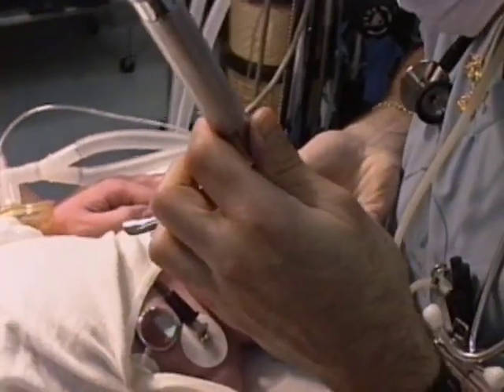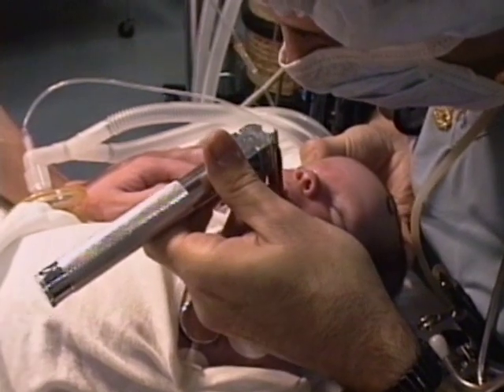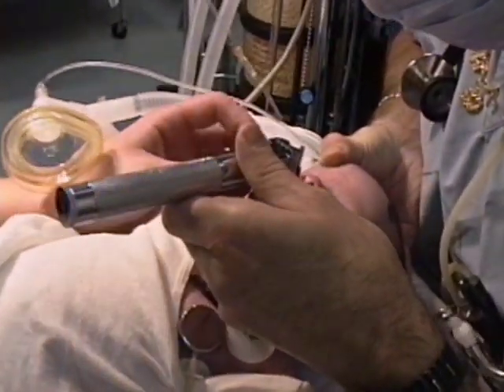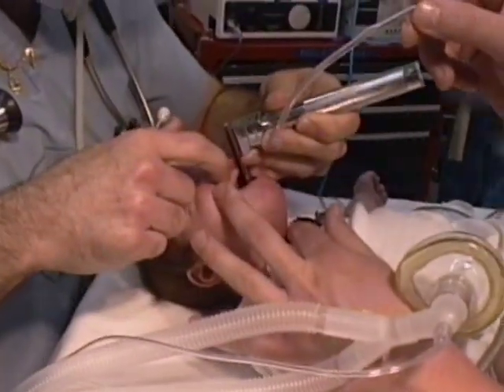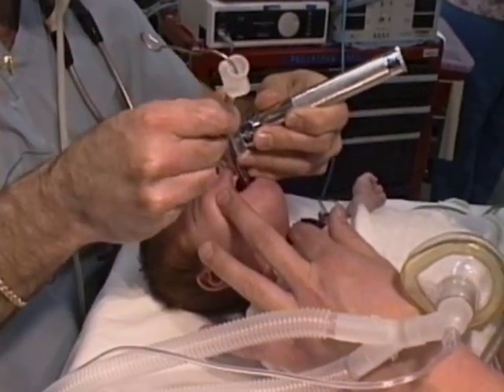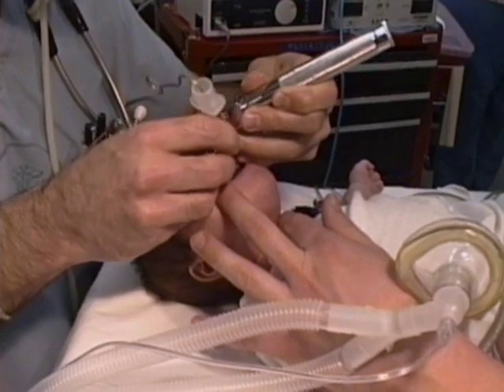Intubation in children requires the same basic equipment as in adults, but the technique used must take into account the anatomical differences. Placement of an endotracheal tube through the larynx interferes with its natural protective functions. Therefore, we must use techniques and equipment during and following intubation to minimize the risk of aspiration.